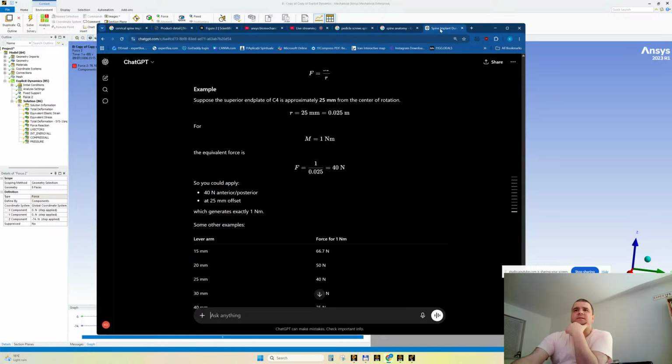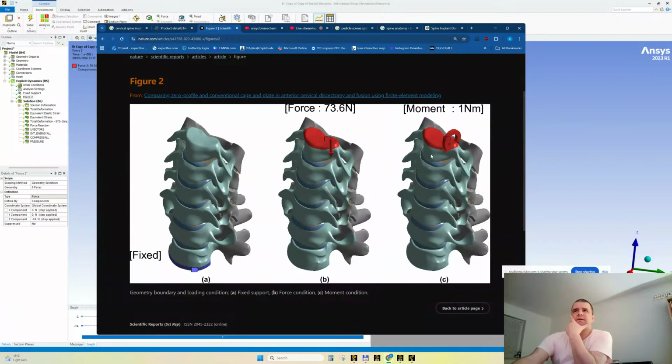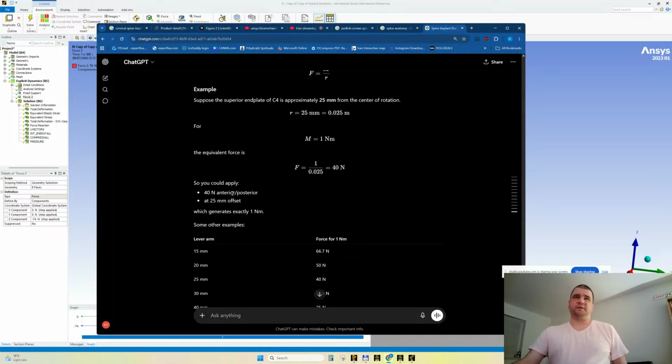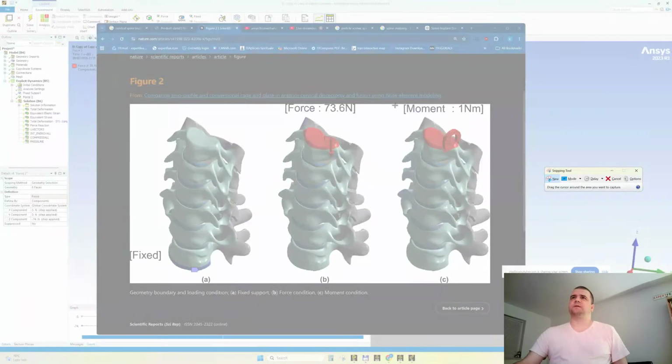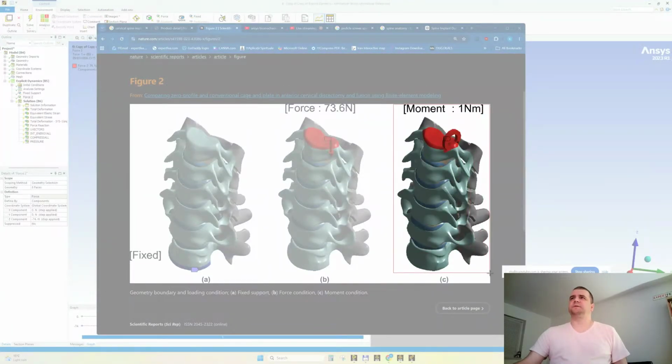Only a small problem is that it says anterior posterior. So the problem is that in this paper, it's posterior anterior. You see, this is posterior side. And this is anterior. The anterior of the spine is inside the body. This is the body side, and this is the outside, the back. So we say posterior to the back. The problem is it says 40 Newton anterior posterior, which is counter to what they say here, because the direction is posterior anterior. Now, who is wrong? I will give a suggestion to ChatGPT and ask it. Maybe ChatGPT is wrong. Maybe.